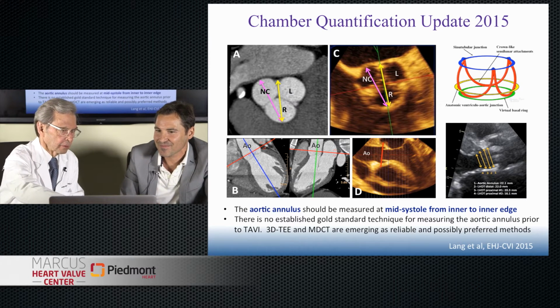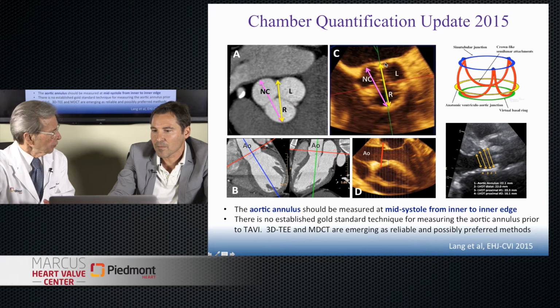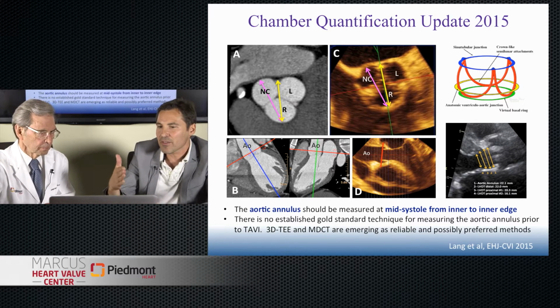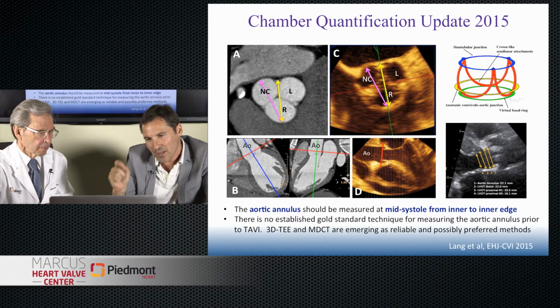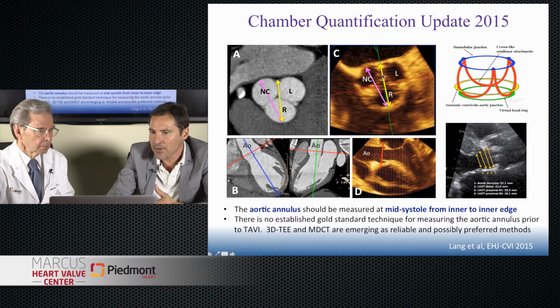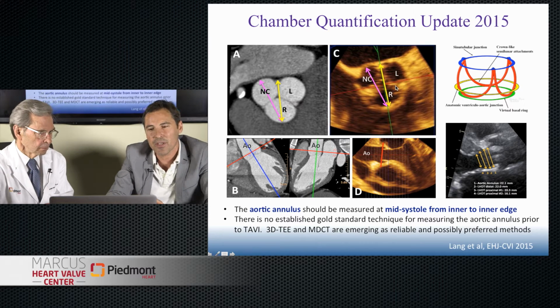And point out to the people that are watching us the top two diagrams, because that's very important, the difference in the red and the yellow arrow. If you measure here or if you measure here, it's not the same. So this means that with echo, we are not necessarily aligned perpendicular and in the really good line to make the measurement. And also what is important is to highlight again that this is almost circular, but in most cases we have a minor and a much larger diameter. So we should be very cautious when interpreting this.